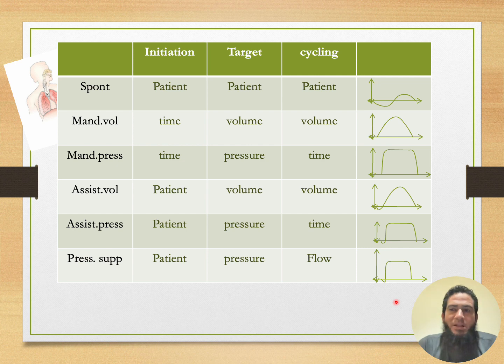For example, if the patient is just coughing or stiffening his chest, not taking any more air, the flow will drop very rapidly. Then, before even reaching zero, just when it reaches 25% of the initial flow, it will start exhalation.